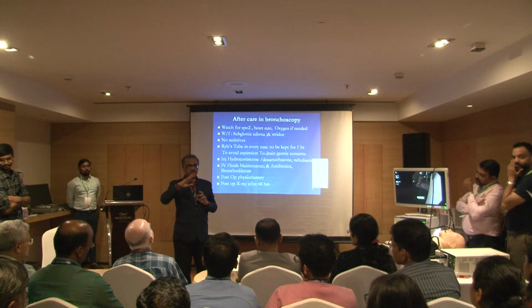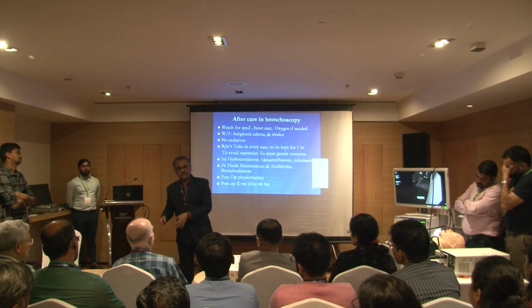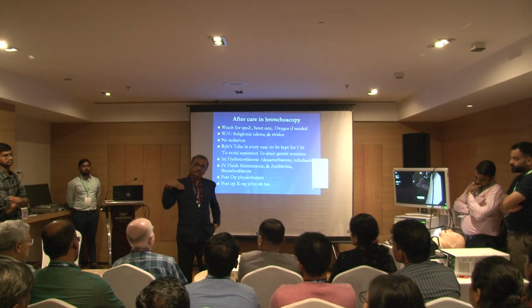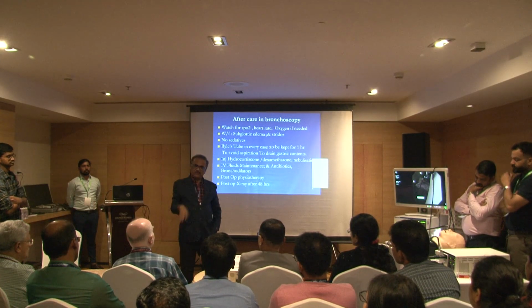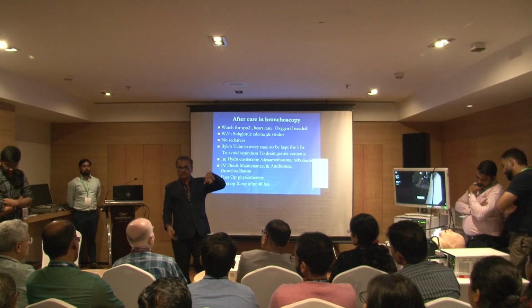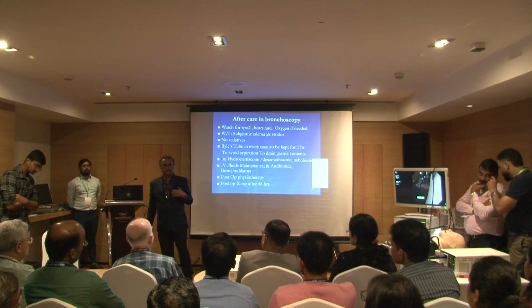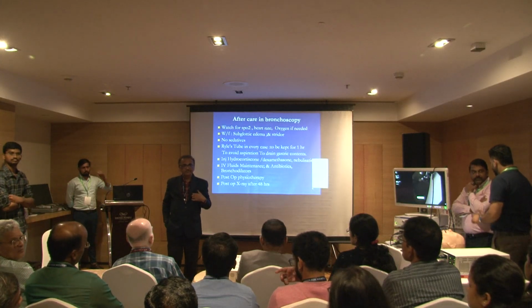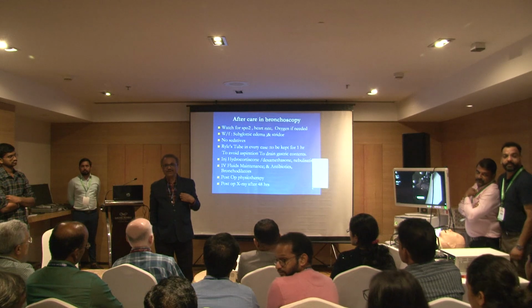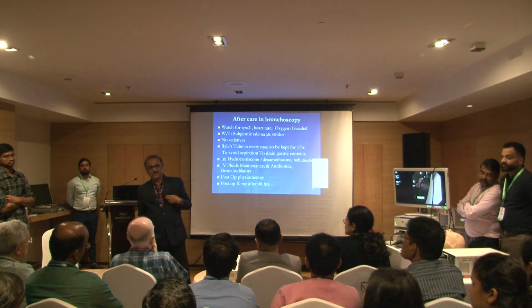So that answers your question, I think. One is shifting your place, shifting the head and turning 180. And then your axis is extremely straight. Then if you are going in a lower lobe, you can slightly lower the head also. Anybody? So what is the success rate of removing the foreign body? And if not succeeded in some difficult foreign body, what to do?